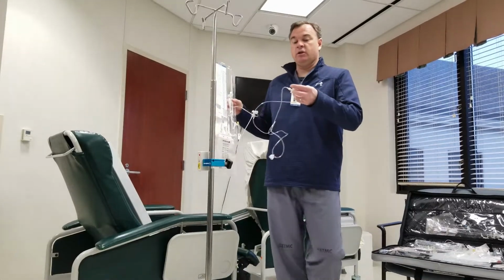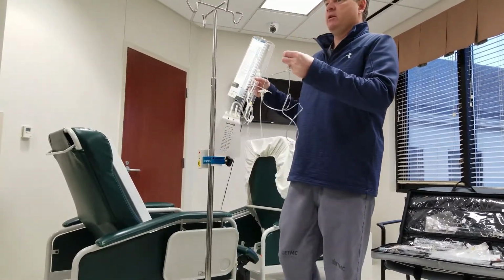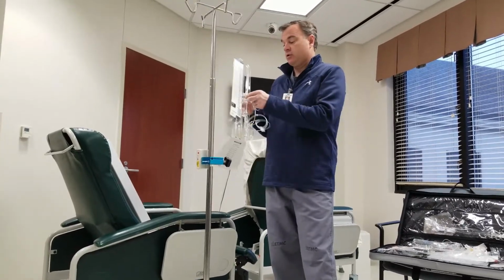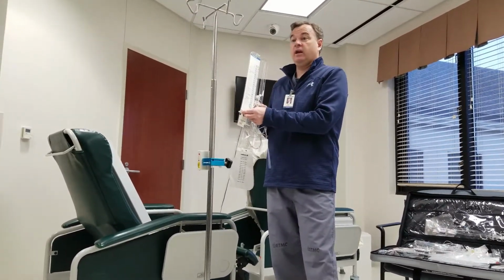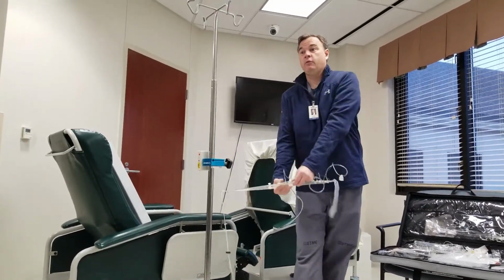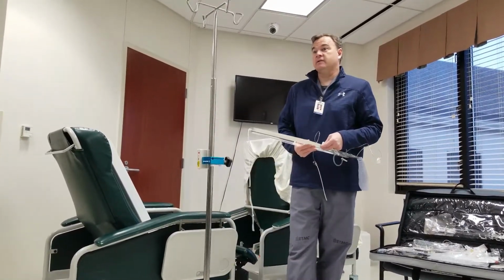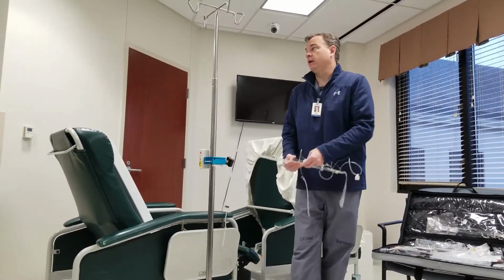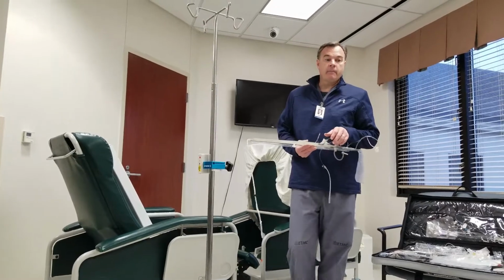The best way to do it is to turn it off closest to the patient. It's a little redundant, but it doesn't hurt. There's a stopcock here. You can't hurt by having both of them off, because if it were to fall here, you're in essence mimicking a bad dural leak. It's now free flowing.